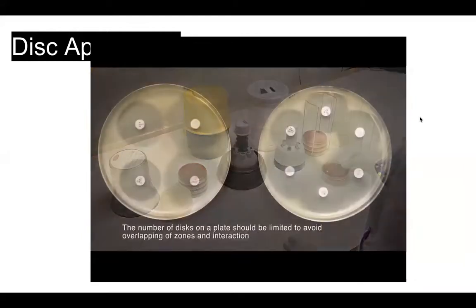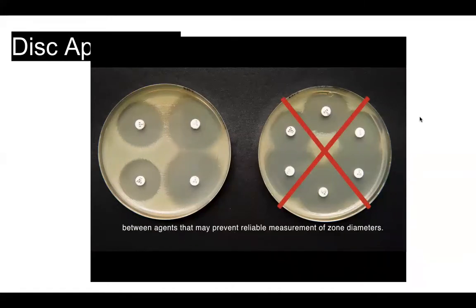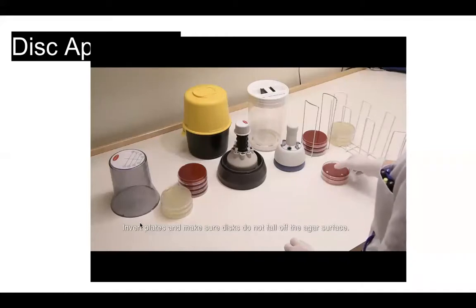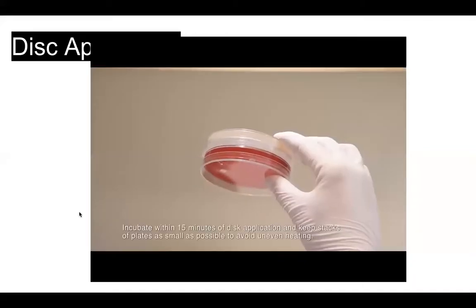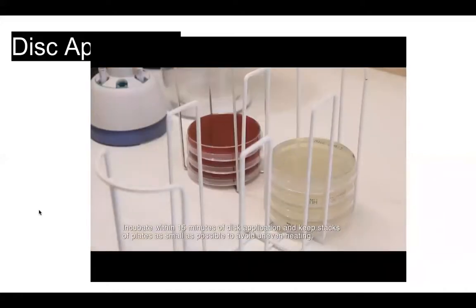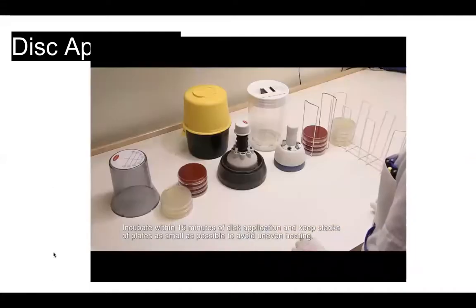The number of discs on a plate should be limited to avoid overlapping of zones and interaction between agents that may prevent reliable measurement of zone diameters. Invert plates and make sure discs do not fall off the agar surface. Incubate within 15 minutes of disc application and keep stacks of plates as small as possible to avoid uneven heating.